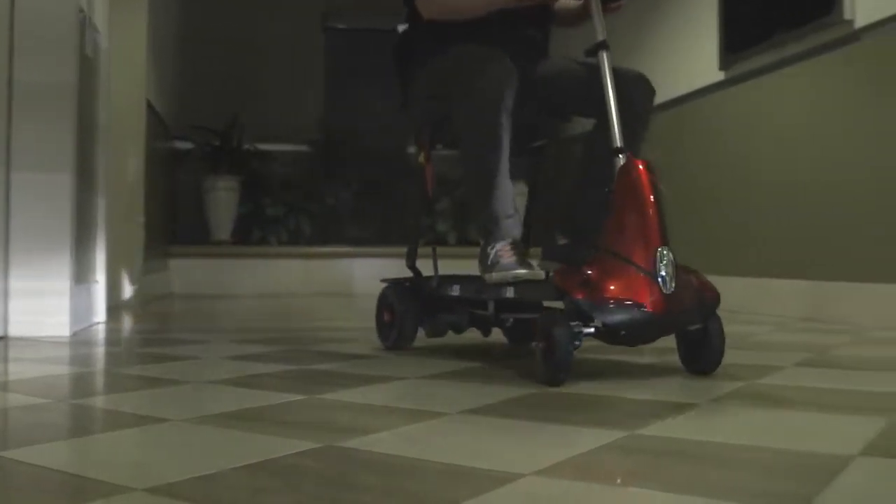Unlike other mobility scooters that require assembly, the Mobi is ready to go right out of the box. No assembly required. Let me just show you how easy the Mobi is to set up. We're going to do it in three easy steps.